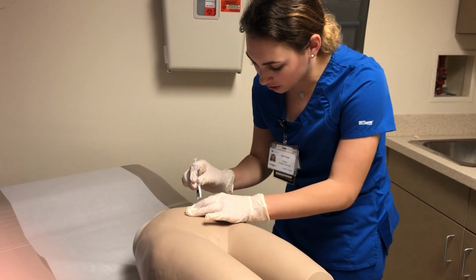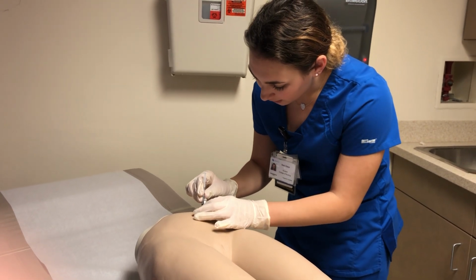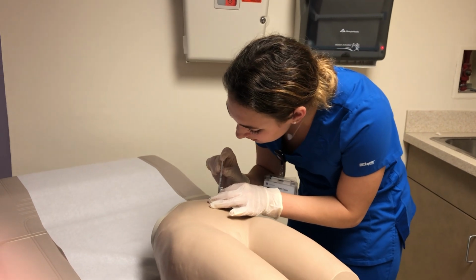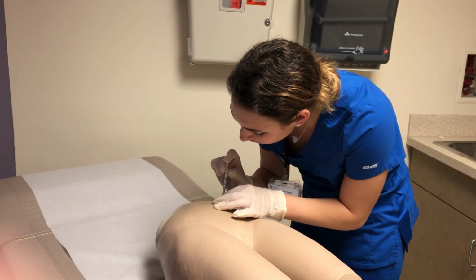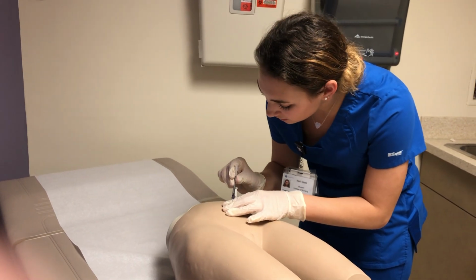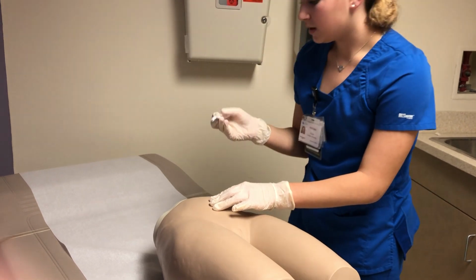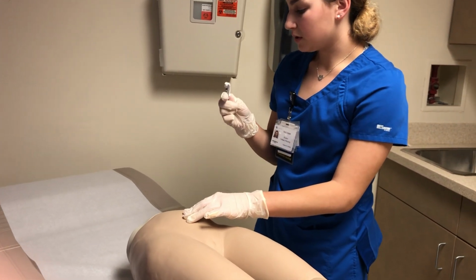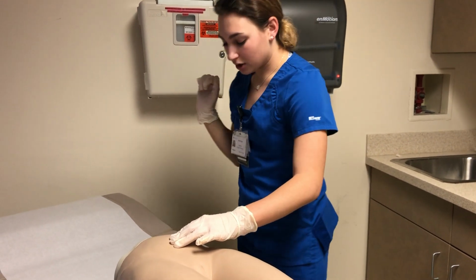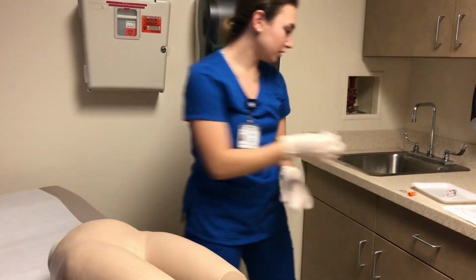So I'm going to inject my syringe into the patient. I'm going to hold at the bottom for stability and inject slowly and steadily. I'm going to move my fingers and pull out. There's no bleeding, and I'm going to push up my safety cap and throw that away in the sharps container. I'm going to discard.